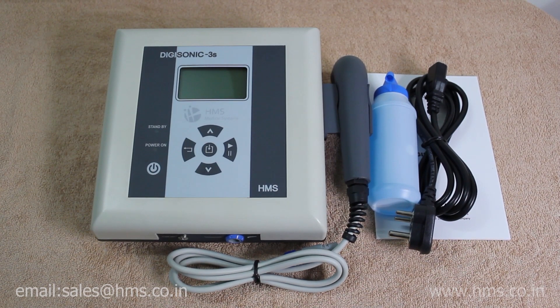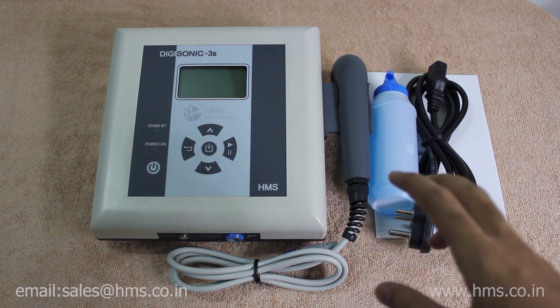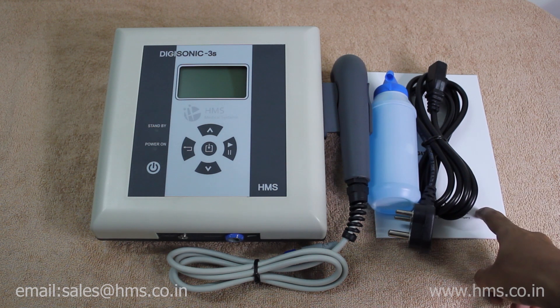This is Digisonic 3S, the third generation of ultrasound therapy from HMS Medical Systems. Out of the box, we provide you with the 5 cm² transducer, a gel, a power cable, and a user manual which can be used to clear all your doubts.